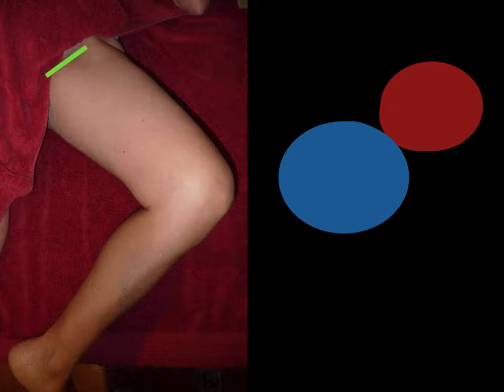We're going to have the patient possibly in reverse Trendelenburg. We're going to get that knee flexed and the hip flexed, and we're going to have that hip in external rotation. Be sure to drape the patient to protect any personal areas, and you may even need to prop the knee up with a pillow or a folded blanket underneath it just to keep them comfortable.